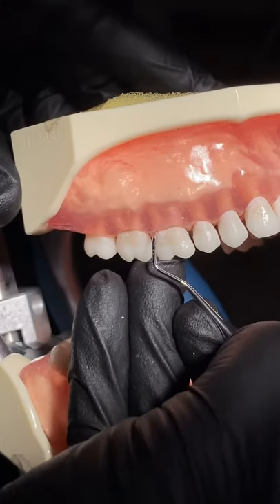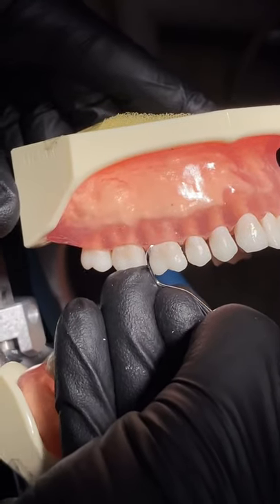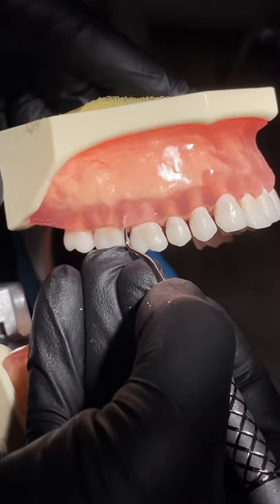We want to achieve 70 to 80 degrees once we're subgingival. So to insert we're going to be at zero degrees, and then we will open up our blade angulation.